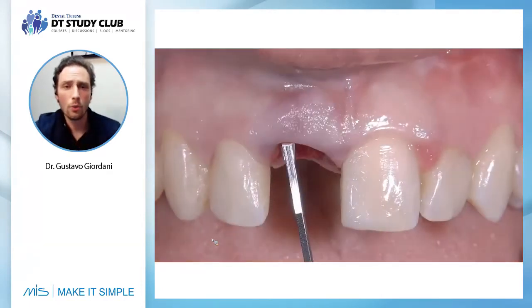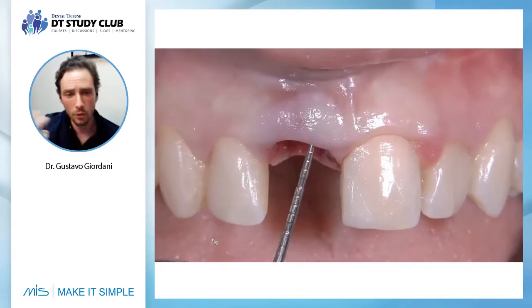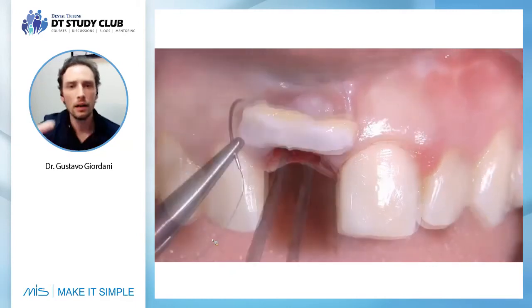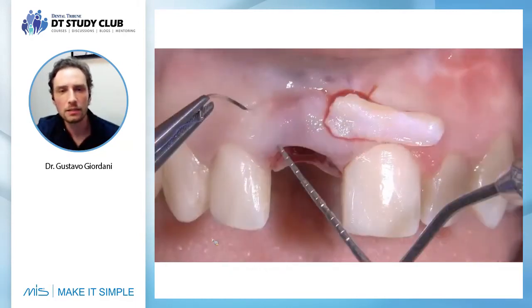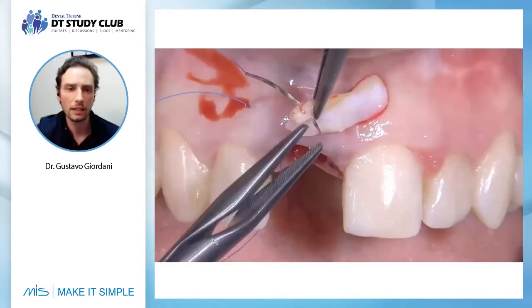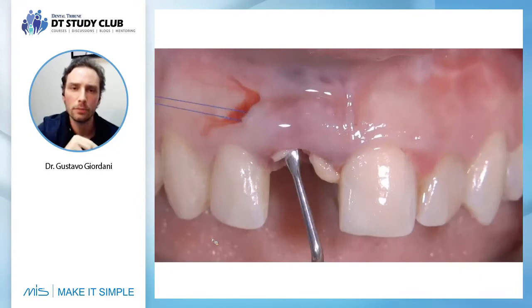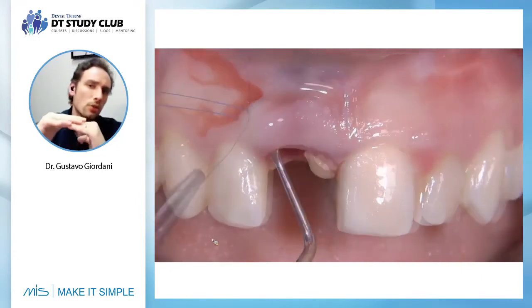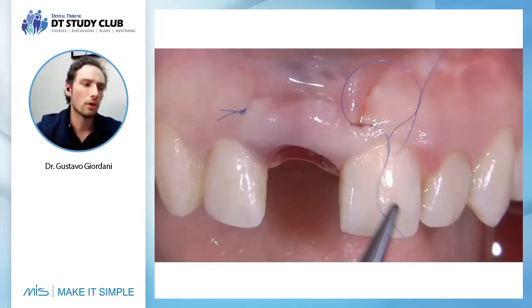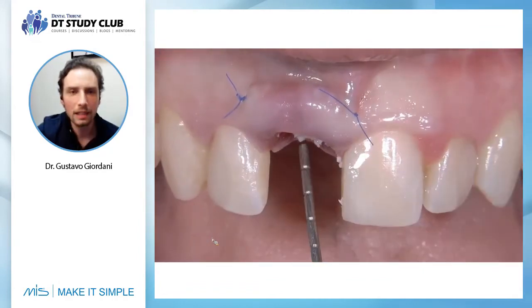So we are now respecting step number 4, which is doing a minimally invasive approach. So we are using now microblades to create this envelope, to create this tunnel, and we take this graft from the depithelialized free gingival graft technique, and we are using now monofilament sutures to suture the graft in position between the soft tissue and the buccal wall to increase the soft tissue thickness and to create a very good aesthetic result and also stability for your case.